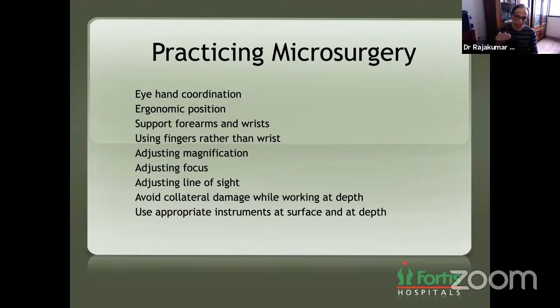And then you start adjusting the magnification and focus depending on the need. I have seen many surgeons over many years get a little confused in anatomy when there is a magnification factor coming into play. So I think it's a process of learning. You can't do it in one day. So learn how to adjust appropriate focus, appropriate magnification for that given surgery.